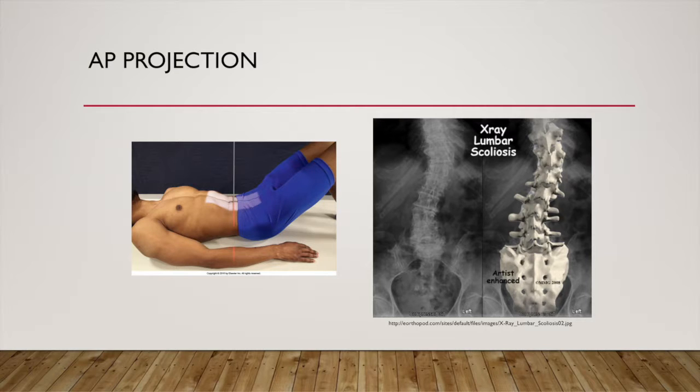For the AP projection, you'll have the patient supine on their back on the radiographic table or standing upright with their back against the wall bucky for weight-bearing methods. Again, this depends on the protocol of the facility you work at. The picture on the left shows the patient in supine position. If it's possible, ask the patient to bend their knees because that will reduce the lordotic curve of the L spine and bring it closer to the IR. Plus also, it's more comfortable for the patient.